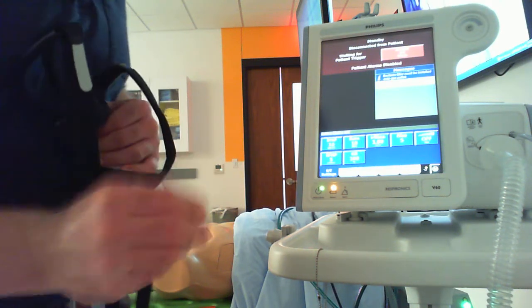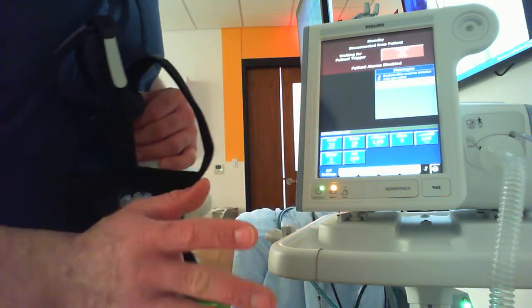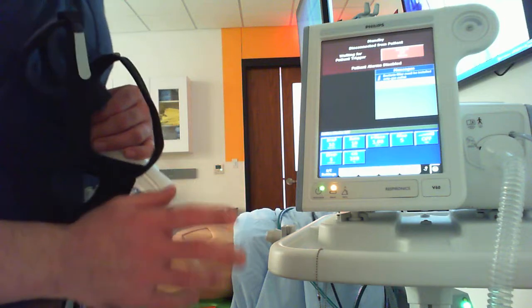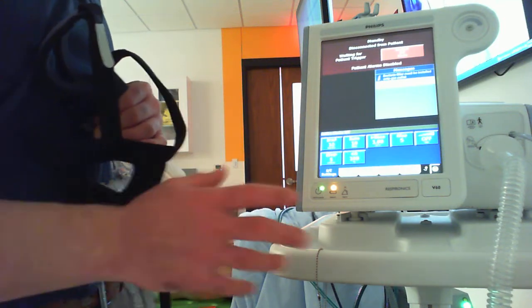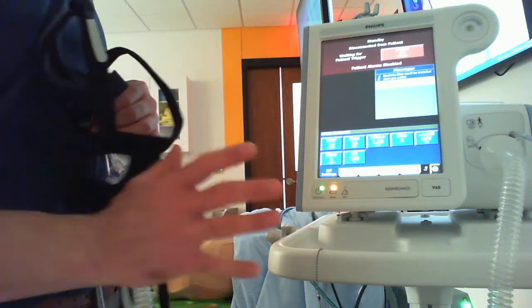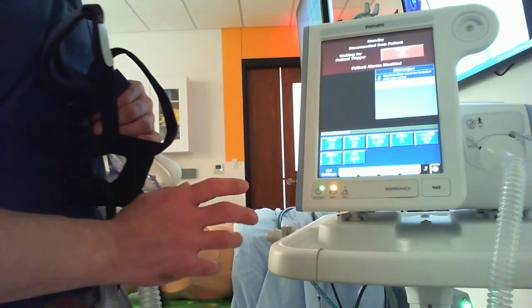Putting your patient just on 10 and 5 and leaving them on that for 30 minutes or an hour and getting a blood gas after when they look terrible and you're not reaching these certain clinical goals, that would be inappropriate, all right? So I start low, but I need to know how to read this machine and how to make proper changes moving forward.